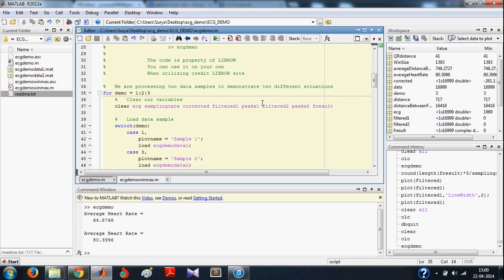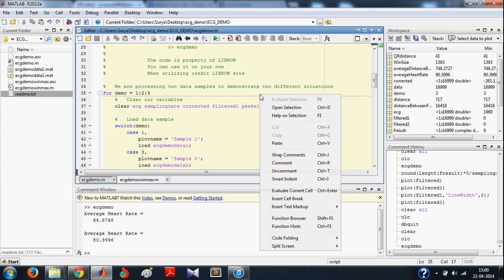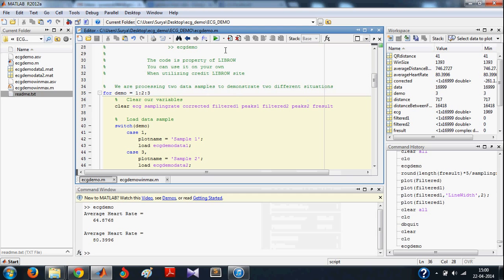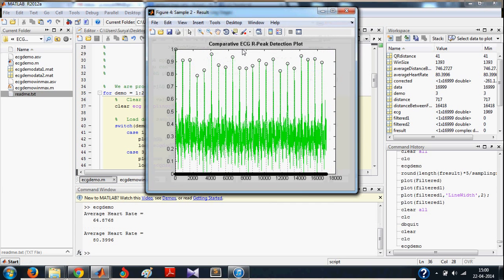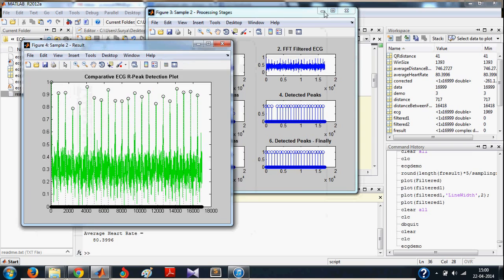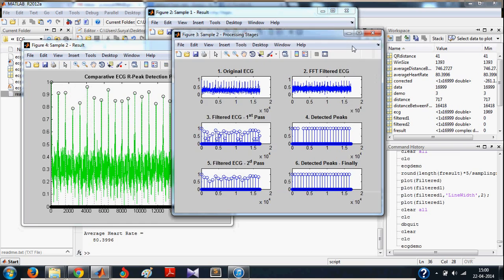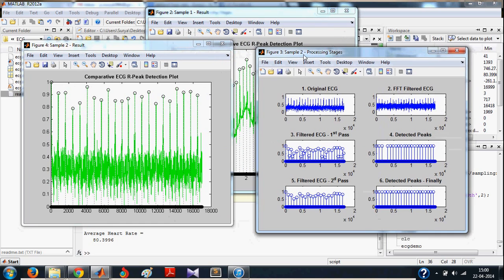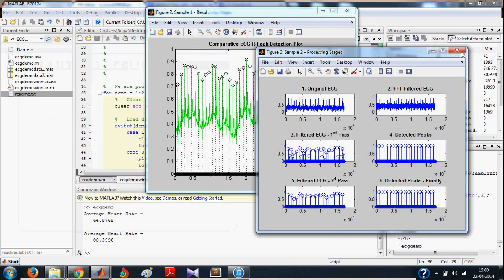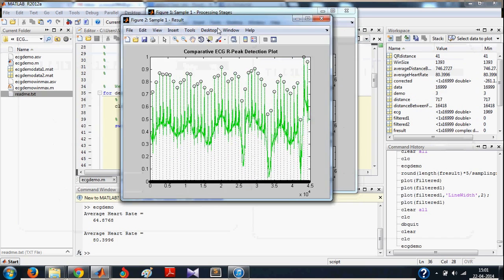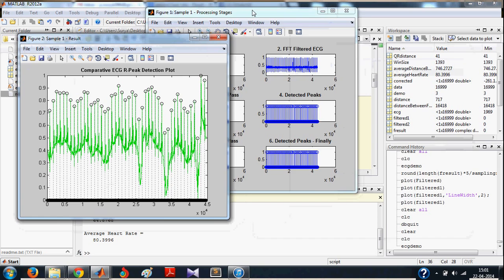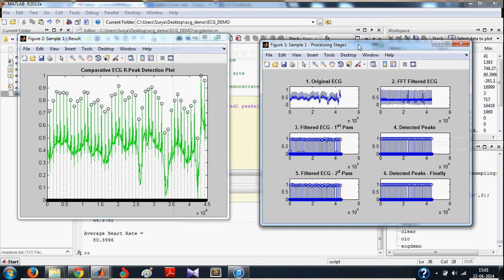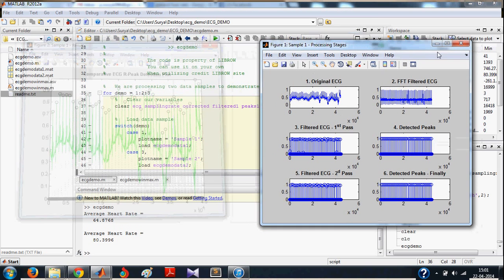As you have already seen how the algorithm works, let us see its implementation in MATLAB. Let me run this first. So this is your output. This is your result for sample 2, and this is your result for sample 1.